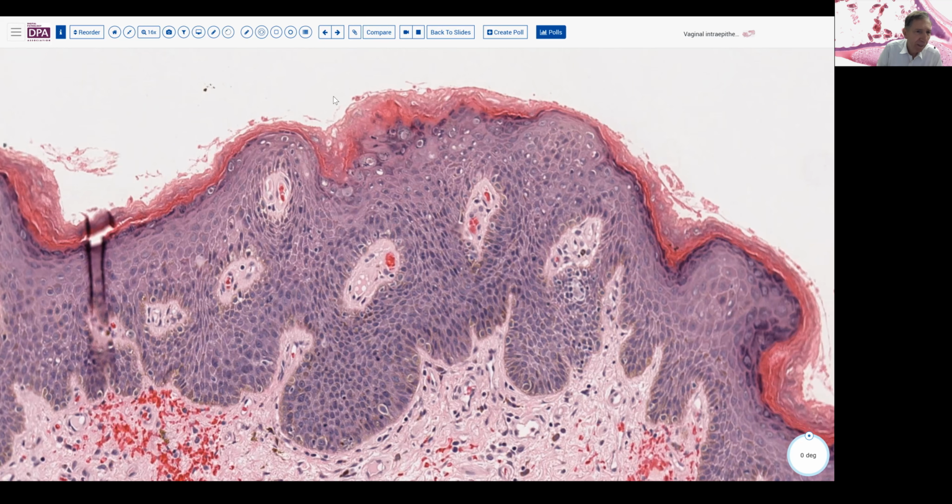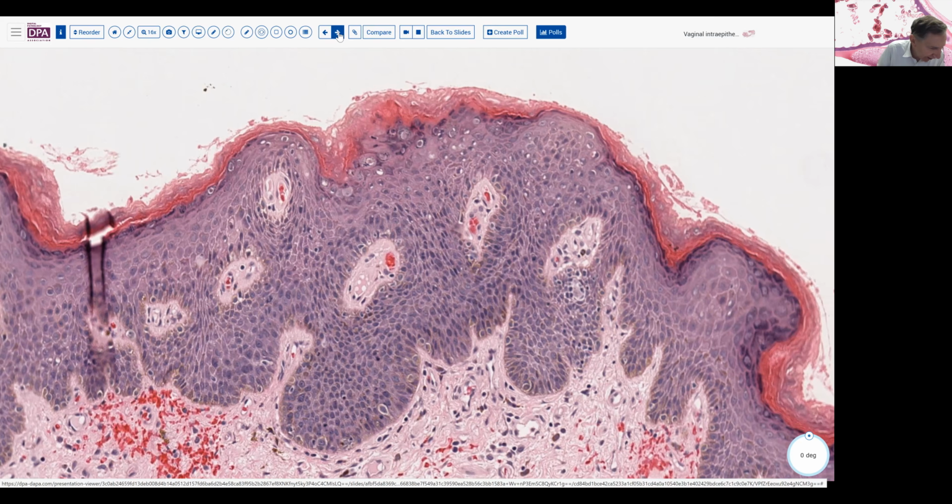So squamous lesions are not highly challenging in most cases, but I did want to cover a few of those teaching points. The variability, the grading, and the fact that vaginal as well as cervical and vulvar lesions can be derived from human papillomavirus. Of course, this underscores the importance of vaccination to prevent as much of this disease as possible.